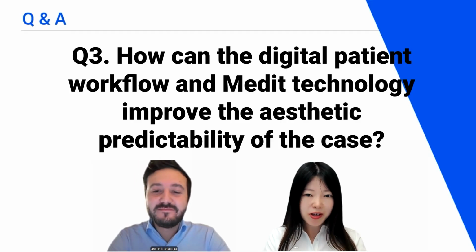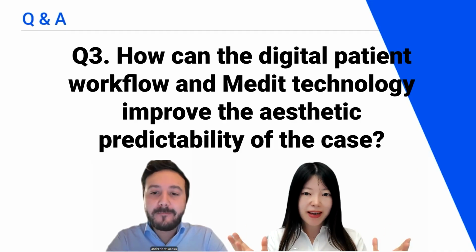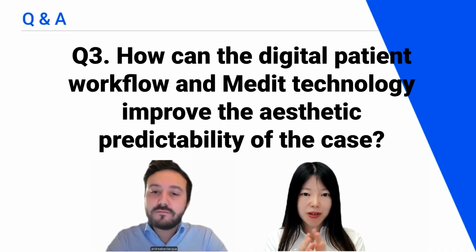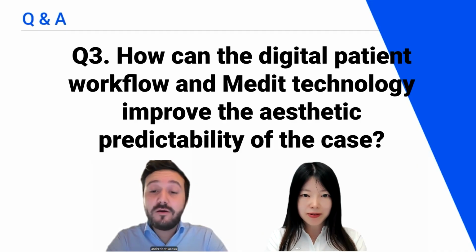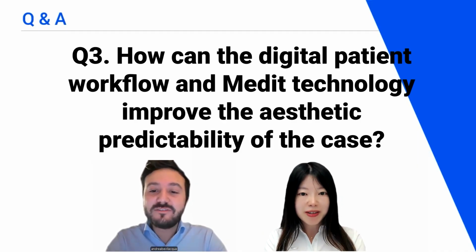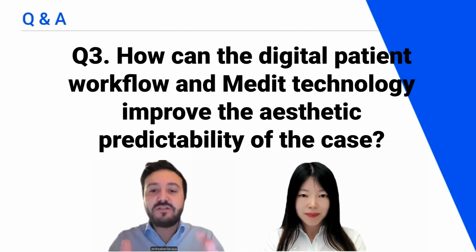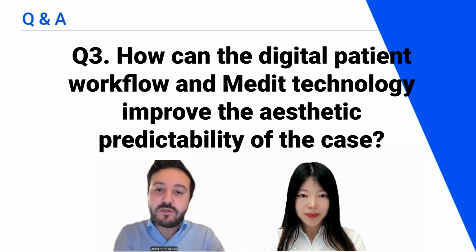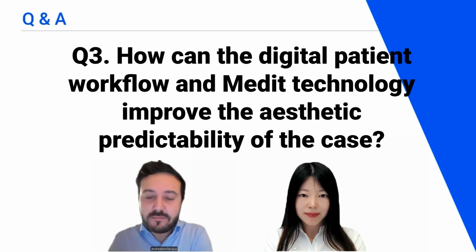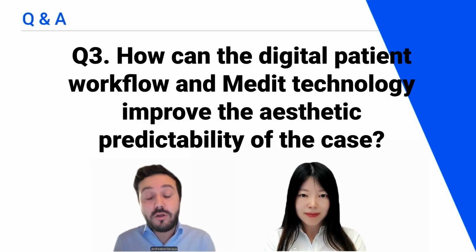Okay, so when you digitize a patient, you do it for big cases, right? Not in small cases, you don't necessarily do it, right? No, every single case. Really? Yes, because you have the pool of your patients that is a digital twin. So you have the digital patient of every kind of patient, because it's not only for the treatment, but also for the diagnosis, and also for the role of the AI.